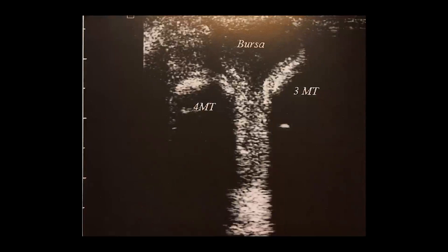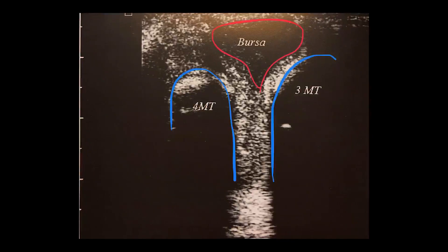Lastly, as discussed before, this is a transverse image at the level of the third and fourth metatarsal heads seen in the short axis view. The third and fourth metatarsals are noted as seen in the image. The bones seen in short axis demonstrate strong echogenic superficial interfaces with posterior acoustic shadowing. Note the complex hypoechoic material distending the third web space, consistent with an intermetatarsal bursa. If compressed, you would note compressibility of this bursa, as opposed to a neuroma which would not compress. Thank you guys for watching — hope you learned something. Until next time.